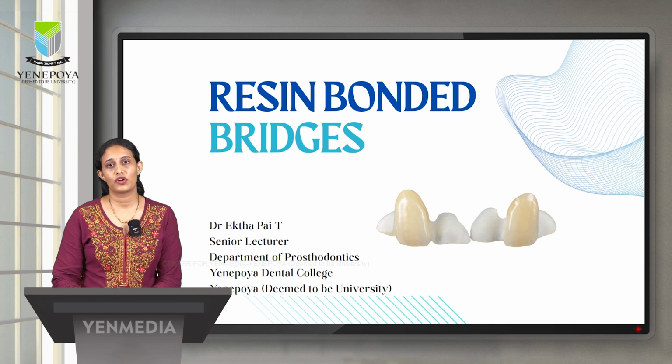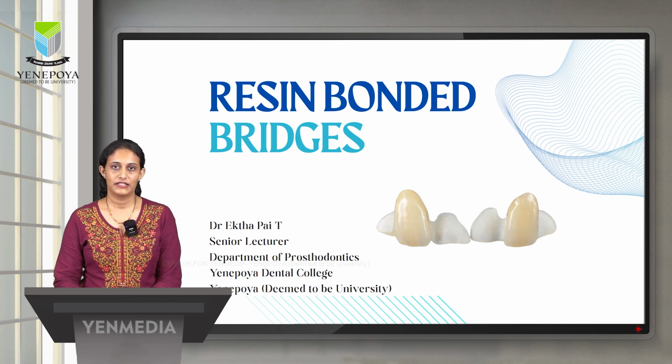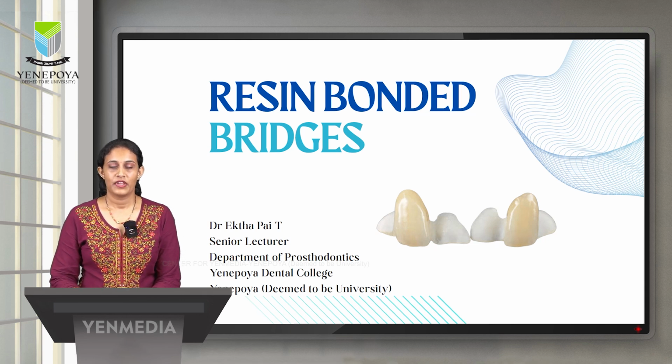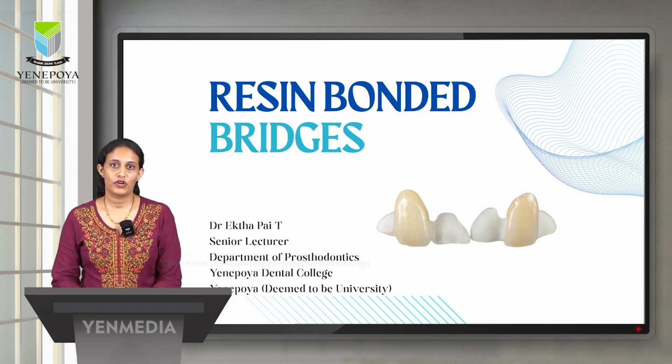Imagine a patient walks into your clinic with a single missing tooth. The first thing that will come to our mind is replace it with an implant. The second thing would be a fixed dental prosthesis or a fixed partial denture. Now I am going to give you a third option, that is a resin bonded bridge. Let us see what this is today.